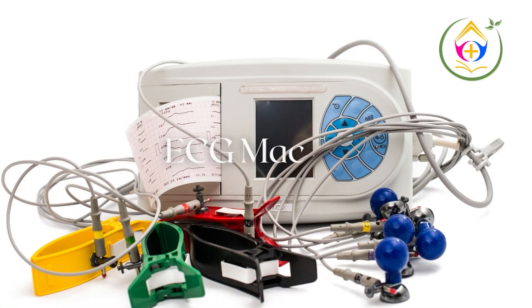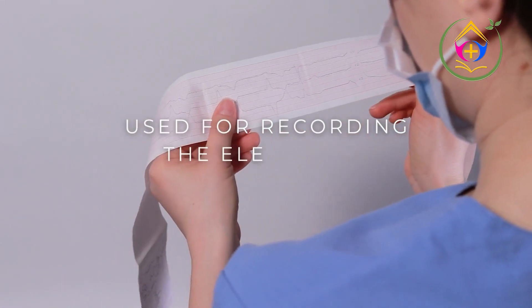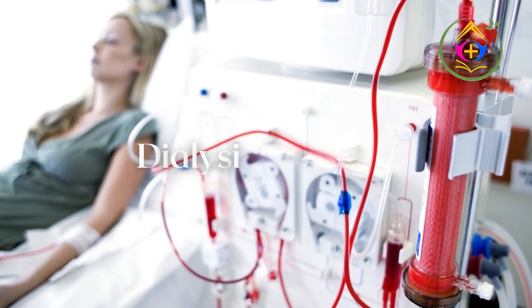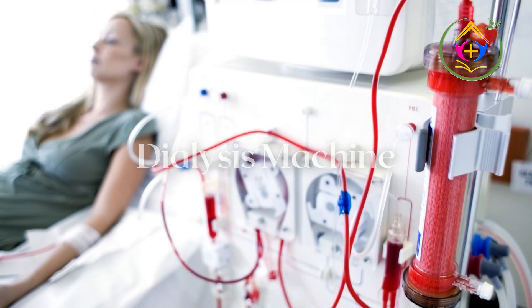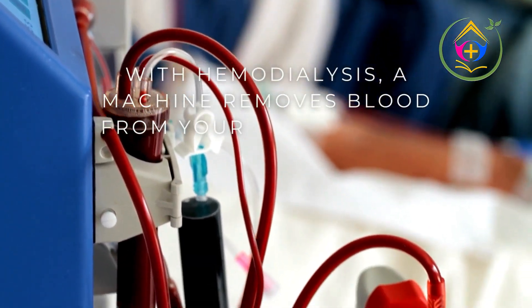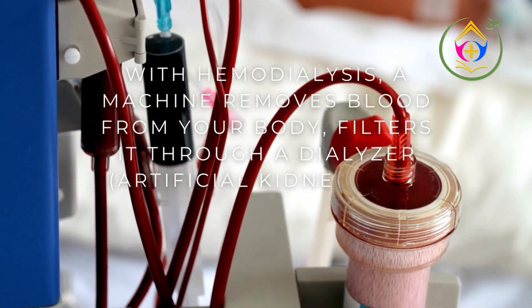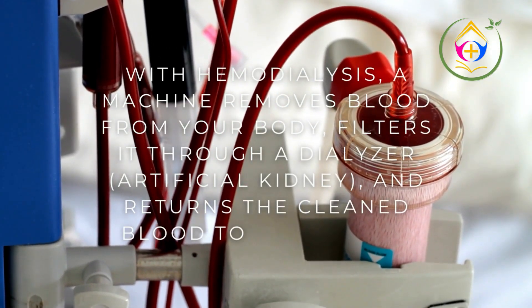ECG Machine: used for recording the electrical activity of the heart. Dialysis Machine: with hemodialysis, a machine removes blood from your body, filters it through a dialyzer (artificial kidney), and returns the clean blood to your body.